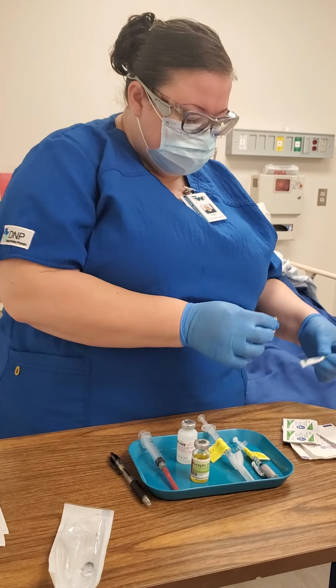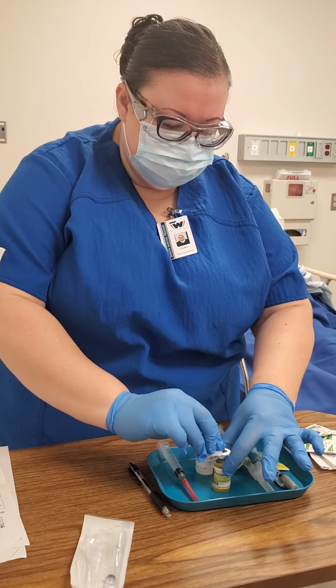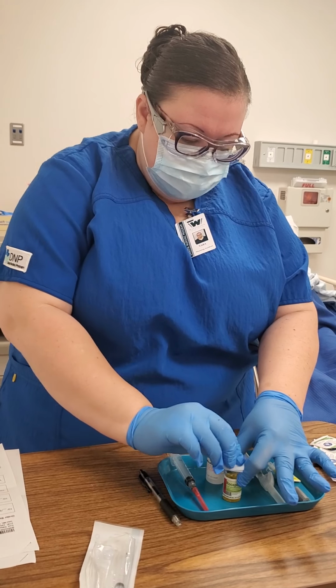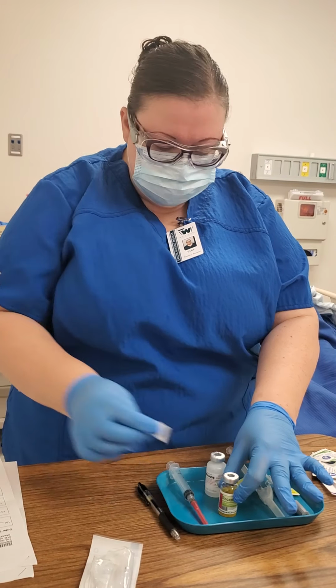Then I'm going to re-sanitize the top of my ceftriaxone just in case, 15 to 20 seconds, that I touched the area while I was mixing it. My hands.